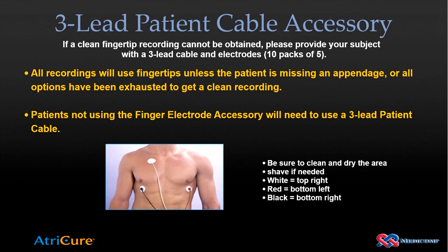As stated before, if a 3-lead cable is needed, you may want to shave male patients who have chest hair. Just spots that are the size of the electrodes in the locations shown. Then instruct them to maintain those areas somewhat free of hair so that the electrodes they will be applying have good contact and are not so painful to remove.